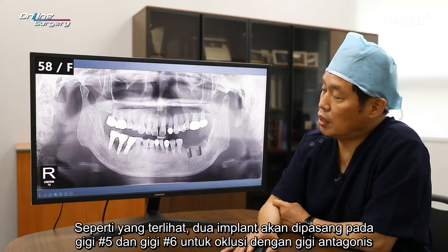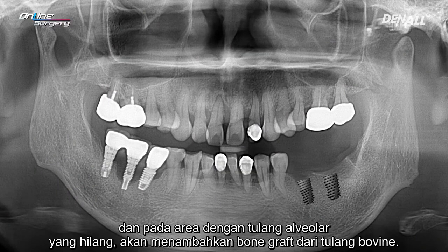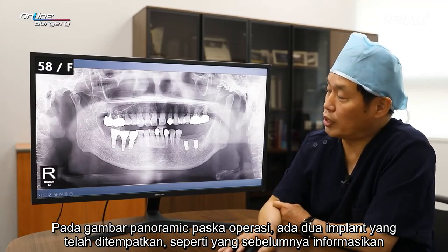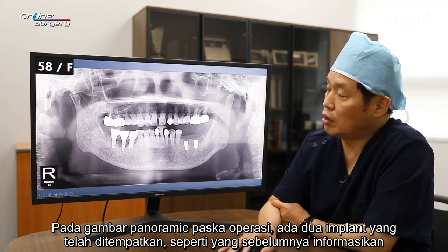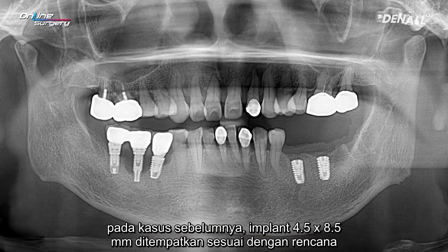As shown, 2 implants will be placed in number 5 and number 6 for occlusion with the antagonistic teeth, and in the area with alveolar bone missing, bovine bone is going to be used for bone graft. Post-op panoramic image, 2 implants have been placed. As mentioned earlier, in the case of number 35, a 4.5 by 8.5 implant was placed, as originally planned.